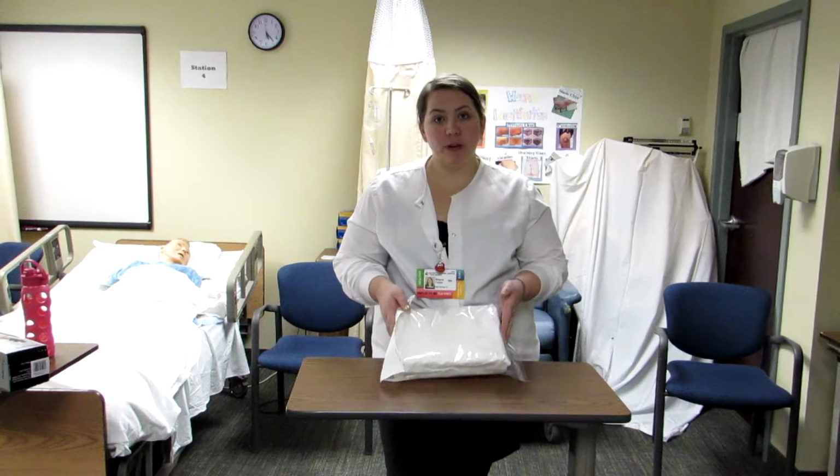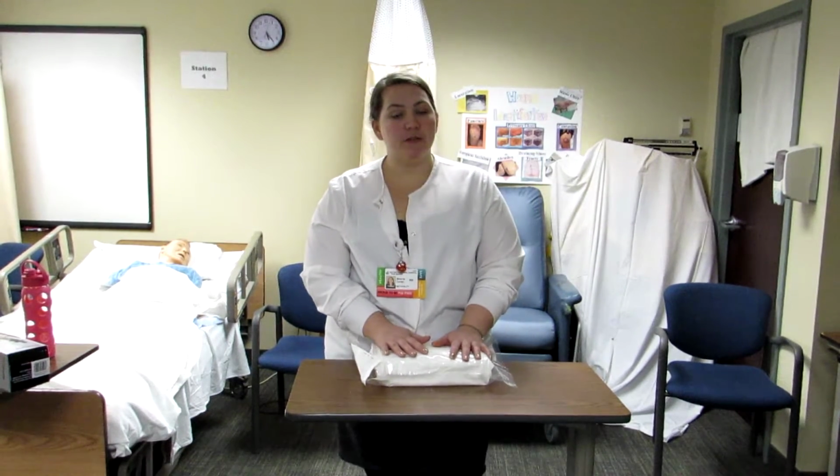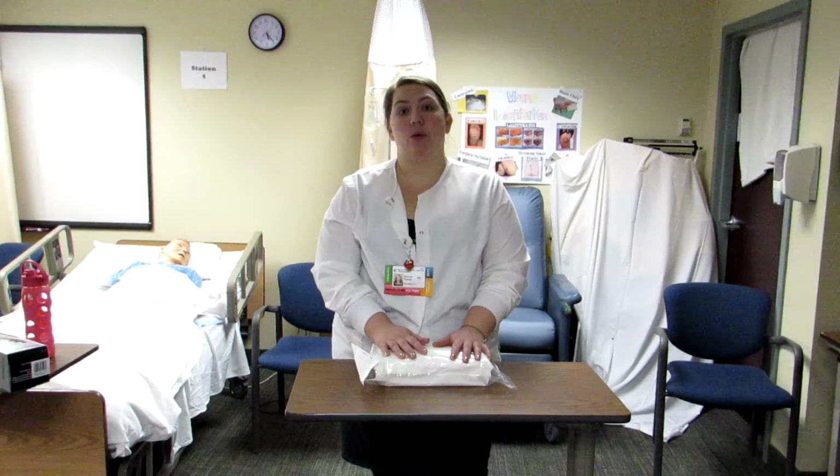So again, I have my Foley catheter kit here. I want to make sure I get a kit before I go in the room. I want to make sure that I have a physician's order before I go into the room. And I want to make sure I know why I'm putting this Foley catheter in. Not just that the physician ordered it, but why do we need it?